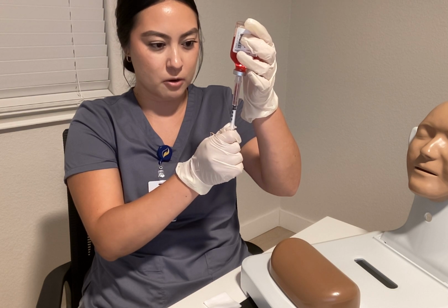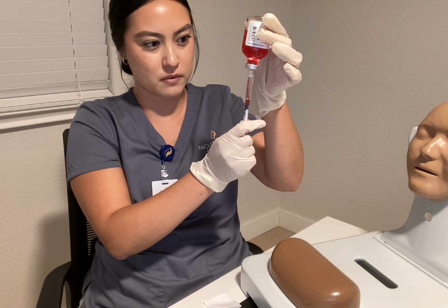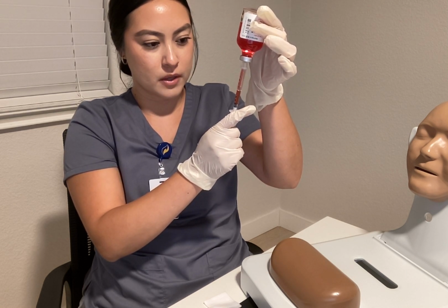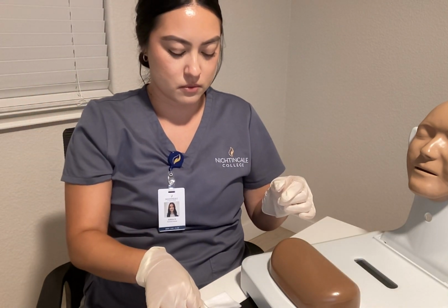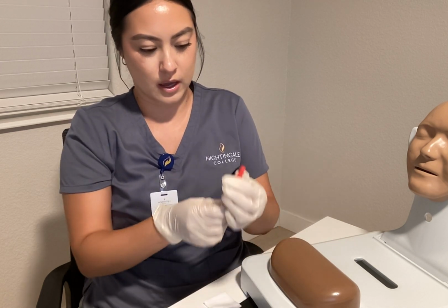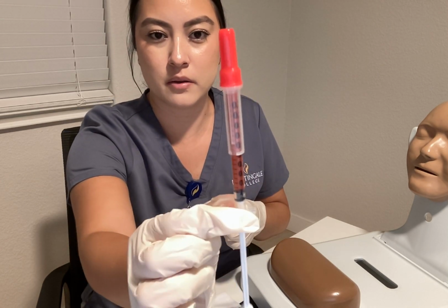And if there's any air bubbles, we can go ahead and push some medication back in to get rid of that air bubble. And we have the 1 mLs drawn up, and we're going to do the sweeping method and then cap this down. Again, we have 1 ml.